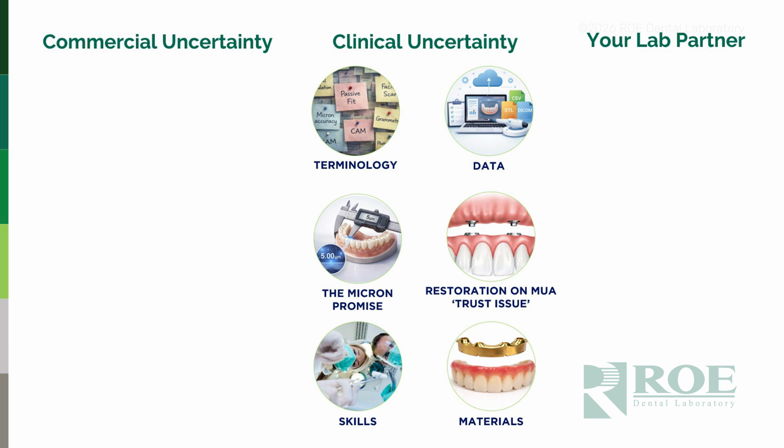We've got lots of talk about microns. And I think some of the confusion here is that there's a natural presumption from many dentists that the accuracy they create at the initial record, whenever they use a certain scanner or photogrammetry, is going to be translated through the entire process. That's not the case. There are lots of steps that a full ArchBridge goes through. So it goes through CAD, it goes through the CAM side, where strategy of the milling machine is important. Then you've got the practical aspect of milling.